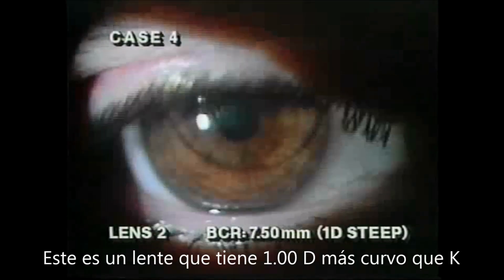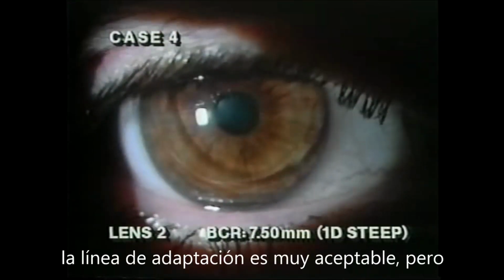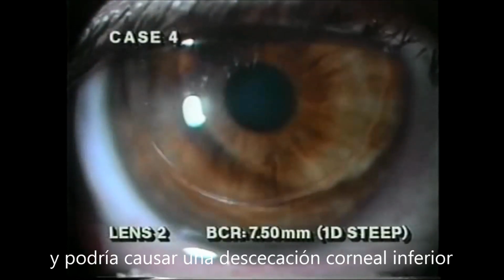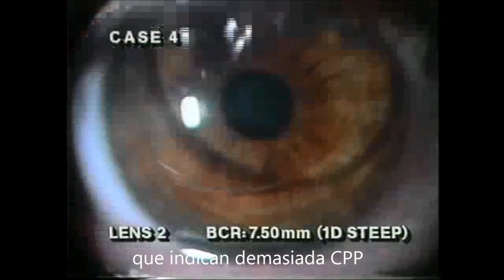This 1 diopter steeper than K fit appears similar to the previous example. Lens lag is more acceptable. Excessive shifting of the tear layer with the blink is present, and the lens occasionally decenters inferiorly. Bubbles are apparent at the inferior edge, indicating excessive clearance.